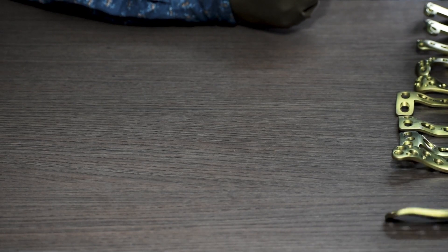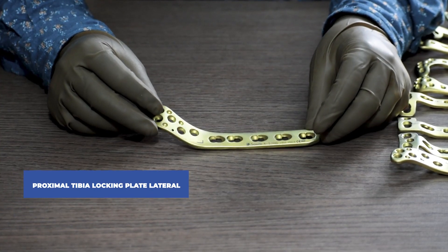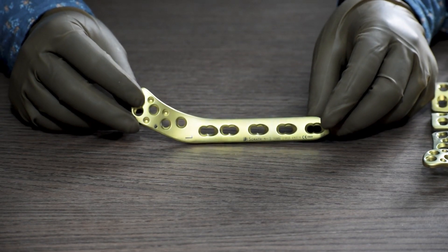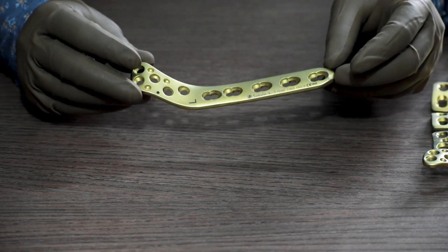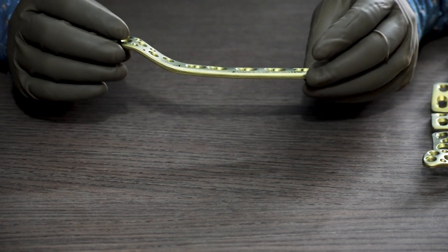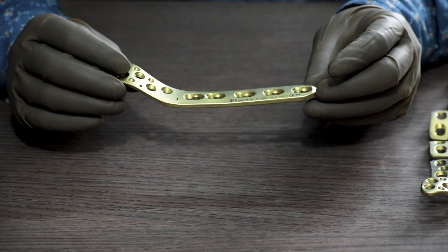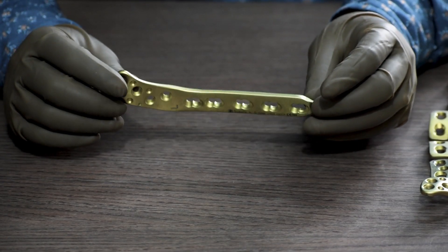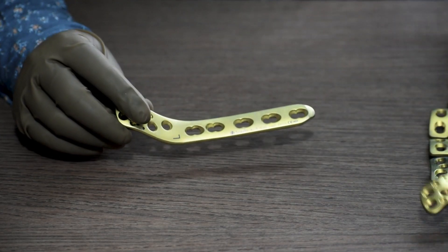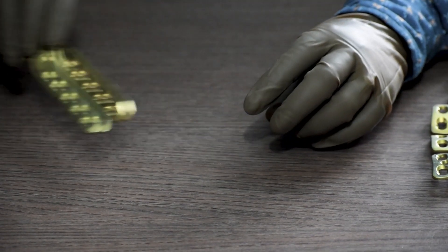Today we will discuss about proximal tibia locking plate. To start with, this is the proximal tibia locking plate lateral. This is a 4.5 system, also known as the hockey stick plate. It is fixed on the lateral side of tibia and is available in different sizes from 5 hole to 11 hole with 2 holes gap in between — 5 holes, 7 holes, 9 holes, 11 holes, and for some companies 13 holes and 15 holes. This is a side specific plate available in left and right.